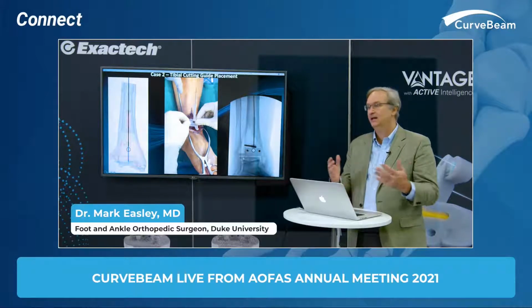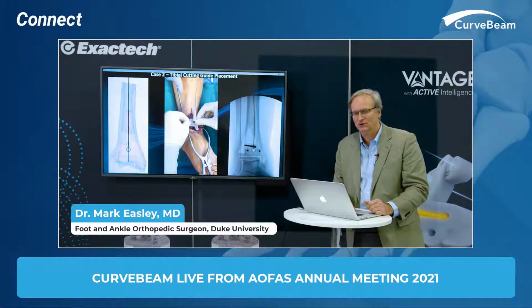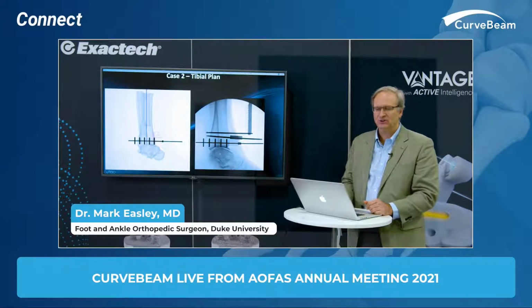Again, ideally I'd get to the point where I no longer need to look at the fluoroscopic image, but I'm still in the phase of checking this just to make sure. These darker areas are the pins that go in. This one that's at an angle is an oblique pin just to hold it even in a better position. So there are many fixation options for this. And then the same thing is true on the sagittal plane.